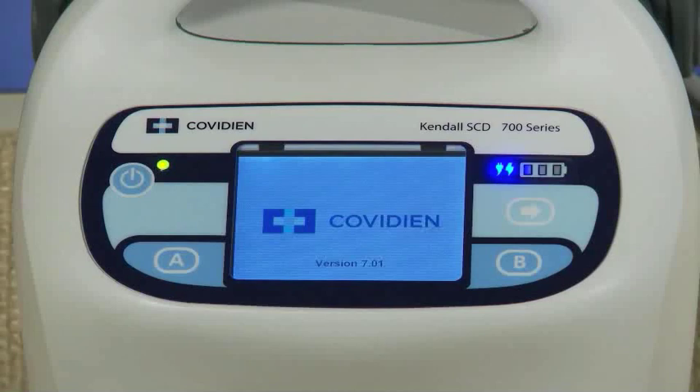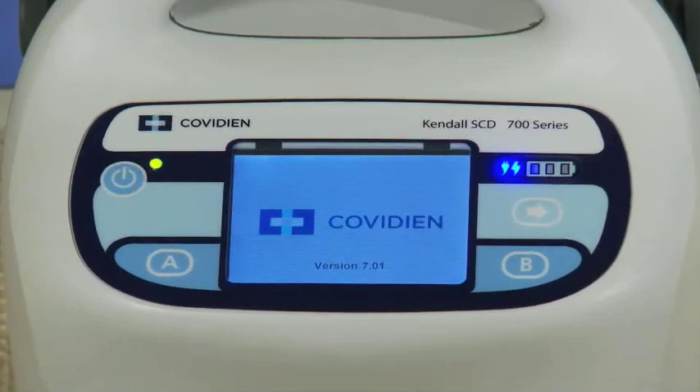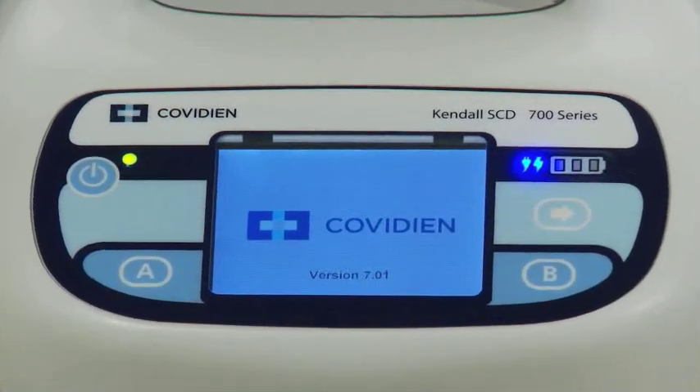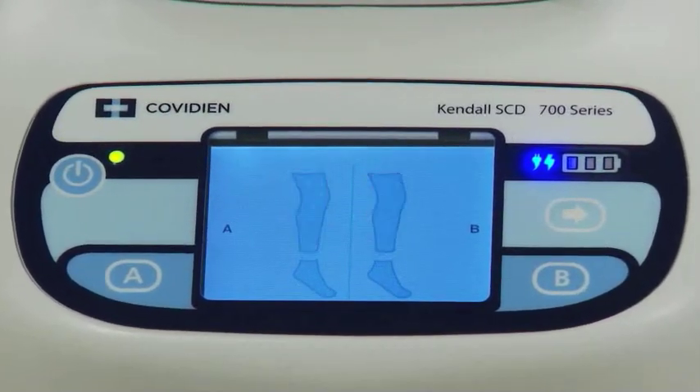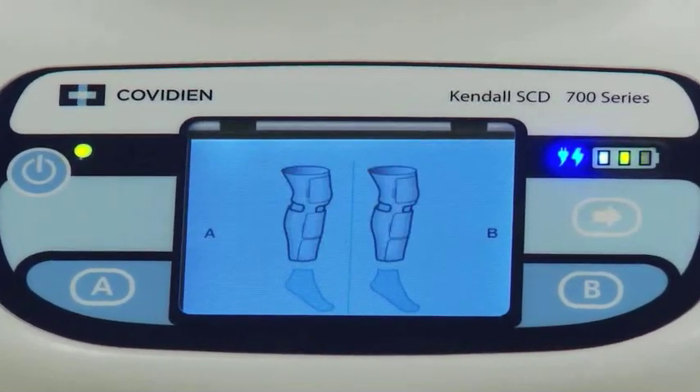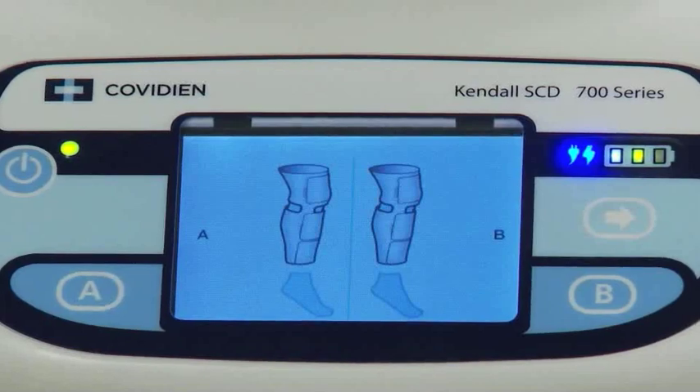The graphical user interface allows end users to identify and address alarm issues, minimizing patient and clinician disturbance and maximizing therapy. The graphical user interface comes with a prominent 3.2-inch color LCD screen that will clearly communicate to the end user how to operate the pump and diagnose alarms.